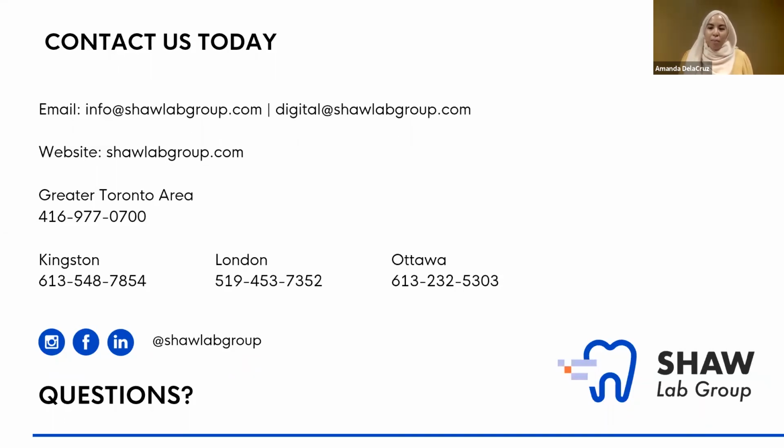With PVS impressions, sometimes the impression material itself is pushing the tissue away from the margin. So something that might have been okay with a PVS impression is less okay with a digital impression, just because there's no compression at all, right? It's just leaving that tissue in place, and it might not be so clear to us.